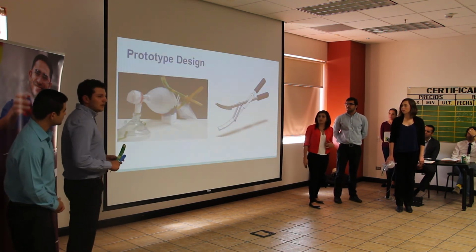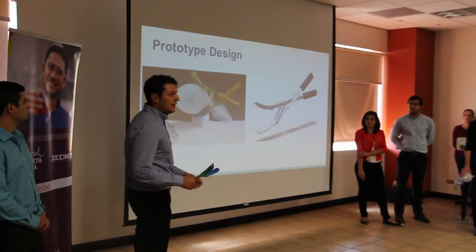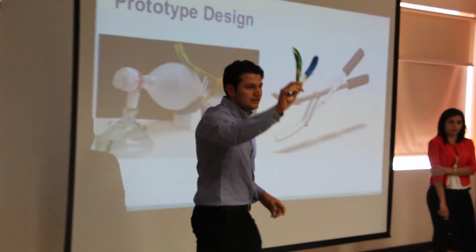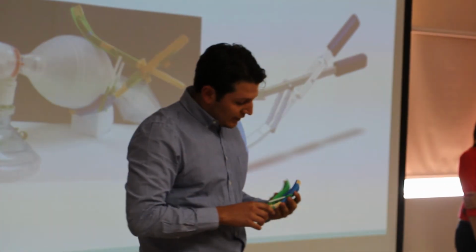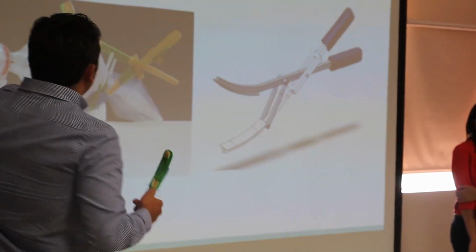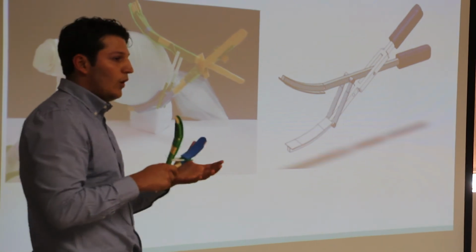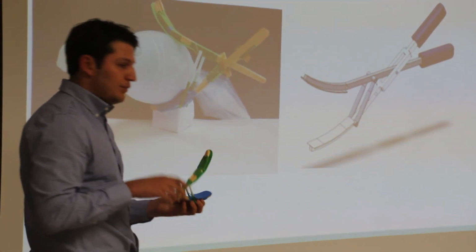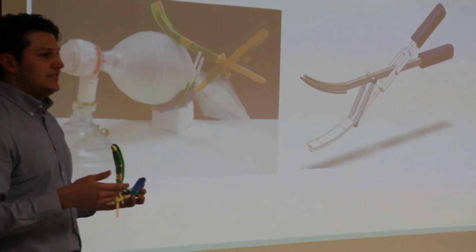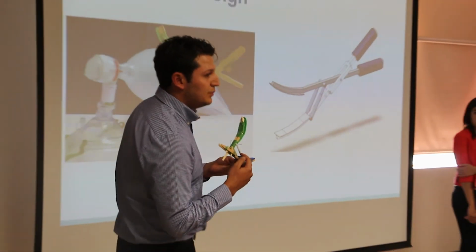Based on the design criteria, we made a low fidelity prototype that I have right here. With this one, we are solving the problems that we mentioned. This design is based on something that is going to hold the bag and push it at a certain frequency that is going to be set by these dashboards.